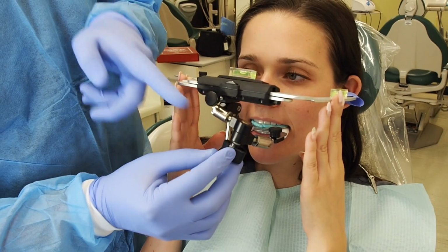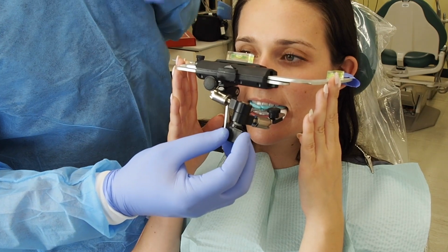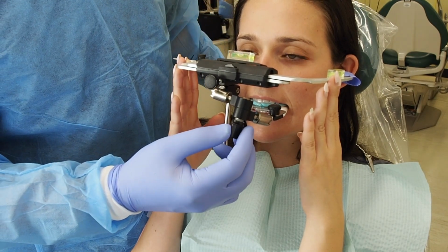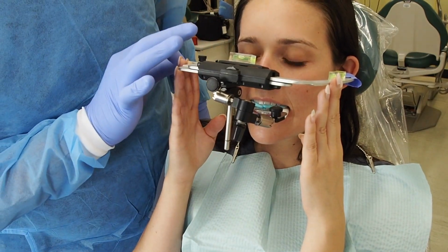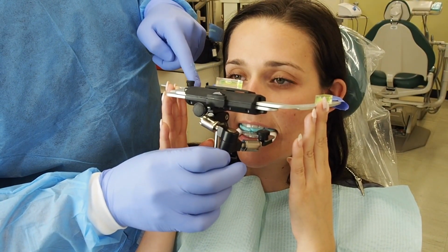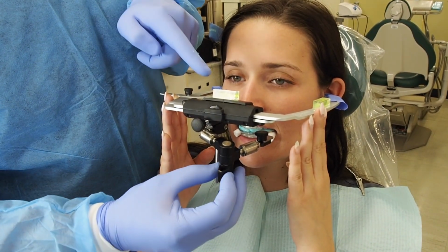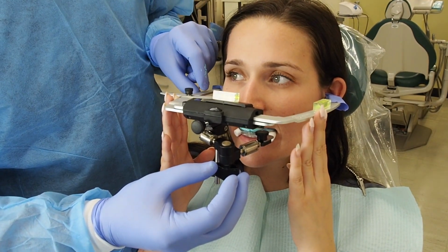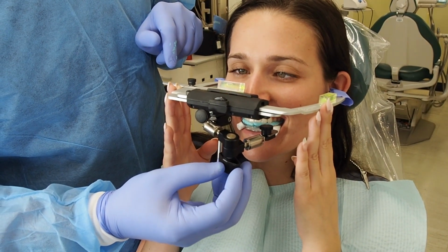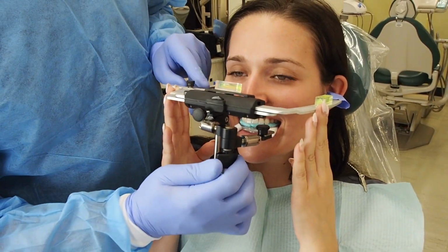Before I secure it, I need to make sure my bubble is right where I want it, right there. Make sure the bubble is right in the center. There you go. You're going to ask my patient that. Is that okay? No, right? You need to lower it down a little bit. Patient, there you go, to where it's in the third point of reference. Is my bubble there? Move this bubble. There you go, right? Once everything is there, then I will secure these.